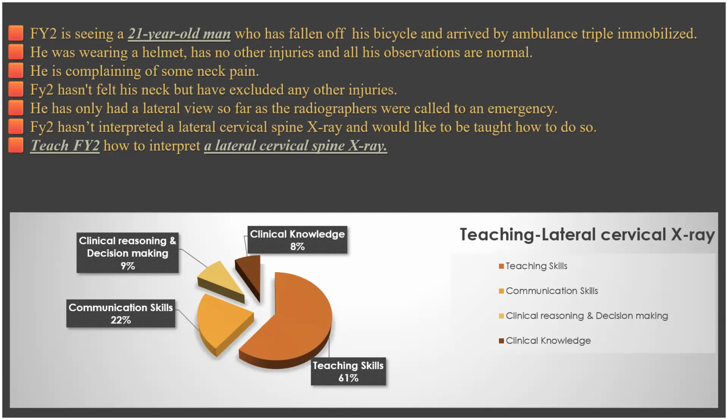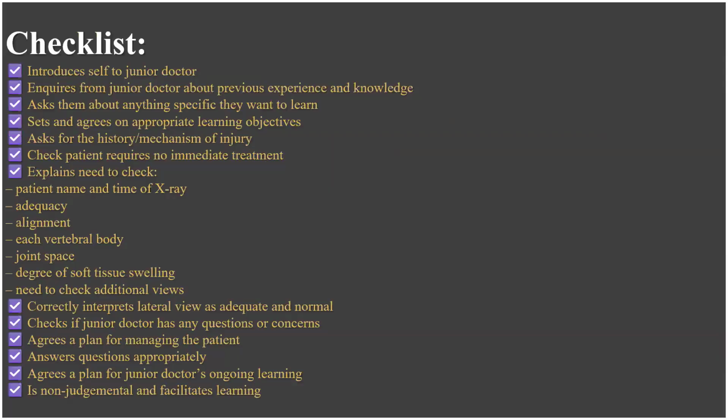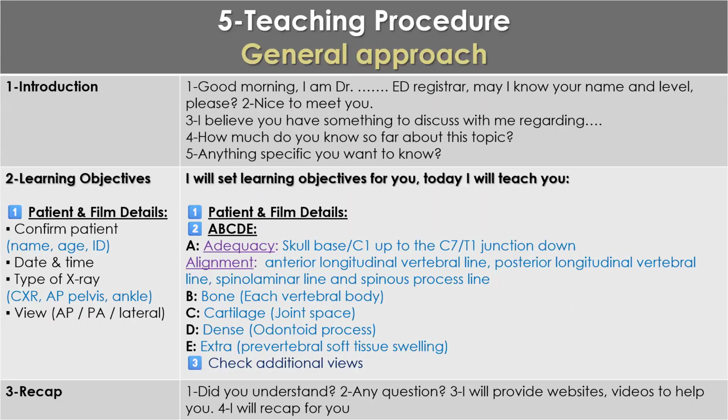You can start. Hello, my name is Dr. Mohammad Abbasan, and I am the ED registrar here. May I know your name and level, please? Nice to meet you. I believe you have something to discuss with me regarding these X-rays. How much do you know so far about this topic? Anything specific you want to know?